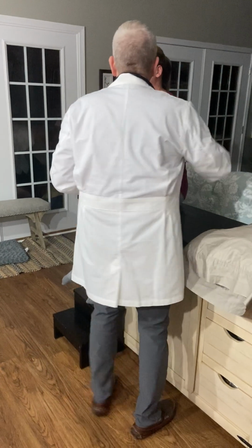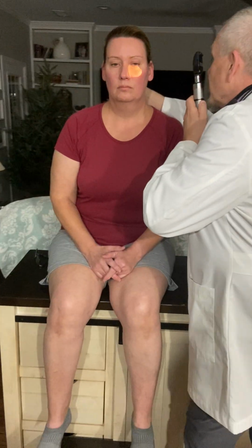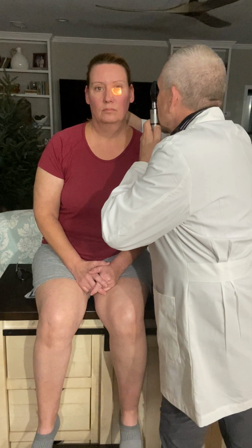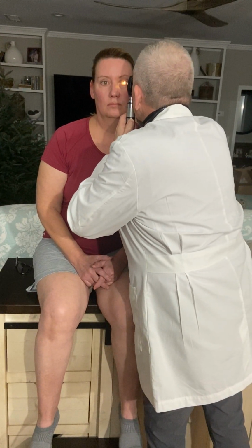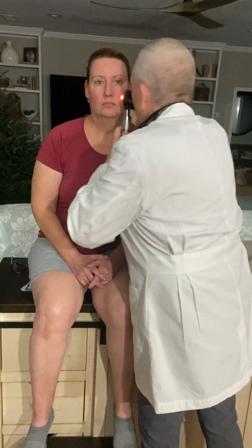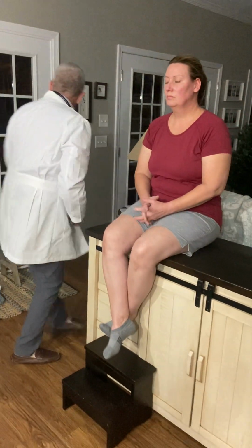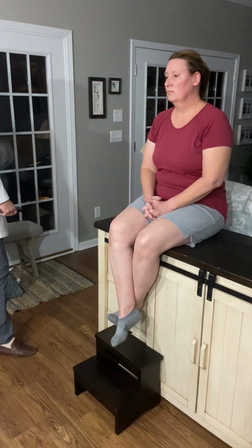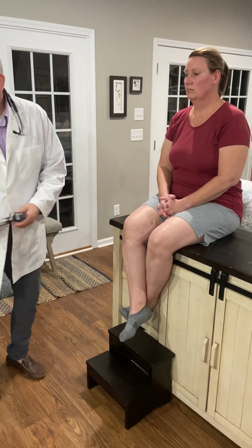Now I'm going to come to this side. I'm going to use my left eye for her left eye, and I'm going to do the same process. Red reflexes are present. And once again, the optic disc borders are well defined, and no papilledema. Okay. And from the eyes, we're going to go to the ears.